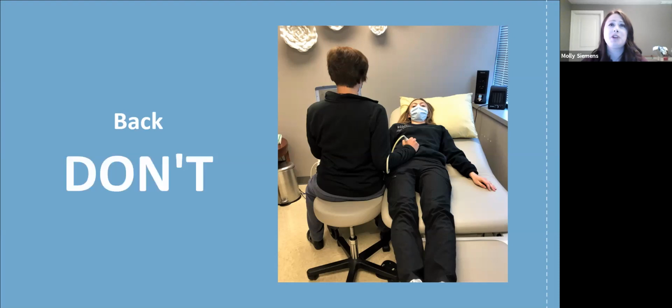Sitting, especially for long periods of time, and in unconventional chairs, such as the stool demonstrated, can distort the shape of the spine by putting pressure on the intervertebral discs. This increased pressure then increases the tension on the muscles, ligaments, and other soft tissues related to the spine. Unconventional chairs, like stools or standard office chairs, can also reduce pelvic mobility by locking those muscles into place.